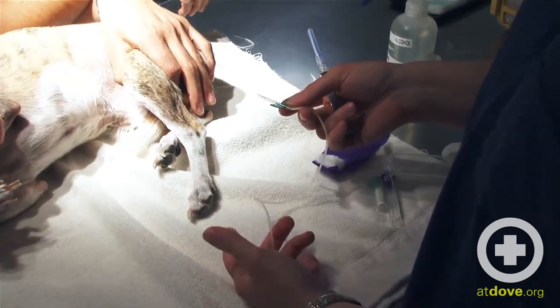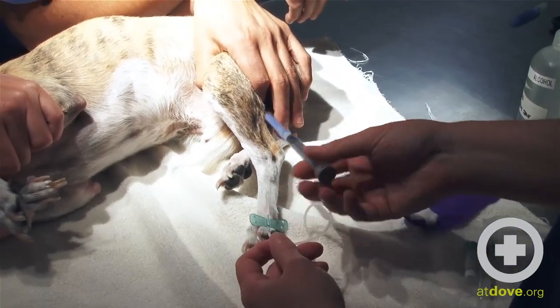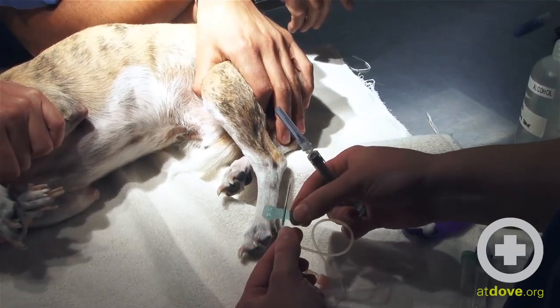This also works well in a patient that may do a little bit of moving. If I've got the butterfly catheter in, he can move a little bit and it's not going to lacerate his vein. If I've got a syringe in there and he moves around, the chances of causing damage are a little bit higher.